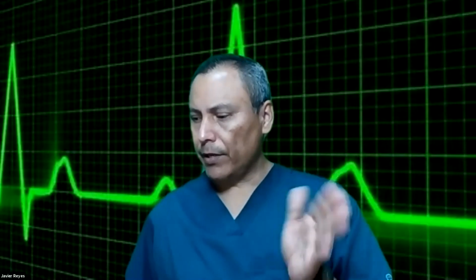Okay, good. You're on the right track. So you look at the rhythm. Are we going to see a regular rhythm with a junctional tachycardia? Yes. Remember, the AV node has taken over, right? Escape rhythms are normal. Everything is regular. Same thing with the tachycardia. They're all going to be regular. P waves are regular. R waves are regular. So, okay, you got that down.